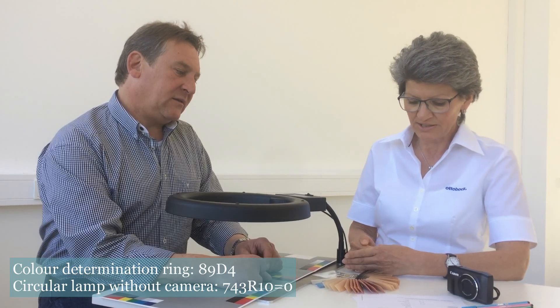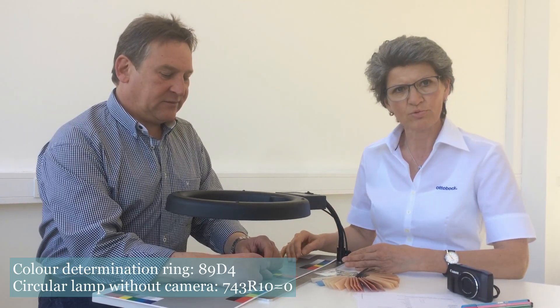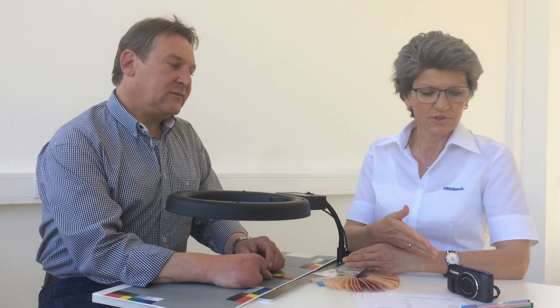To determine skin tones, I need the color determination kit including the color ring, the circular lamp and the color determination sheet, as well as the camera and order documents.